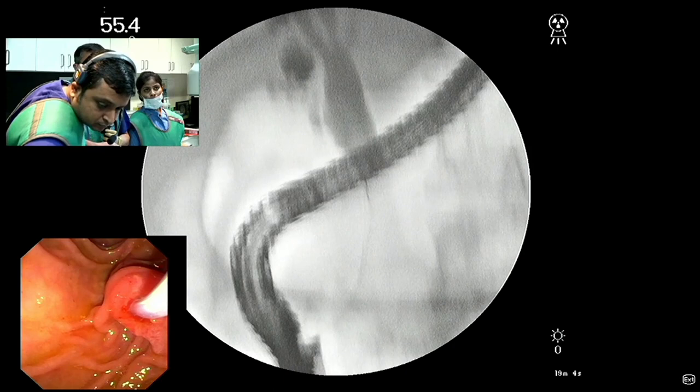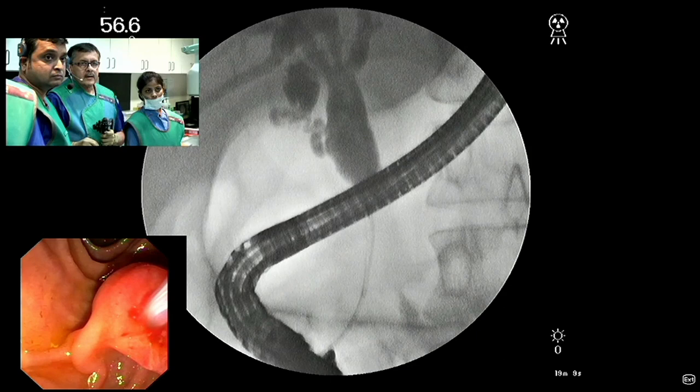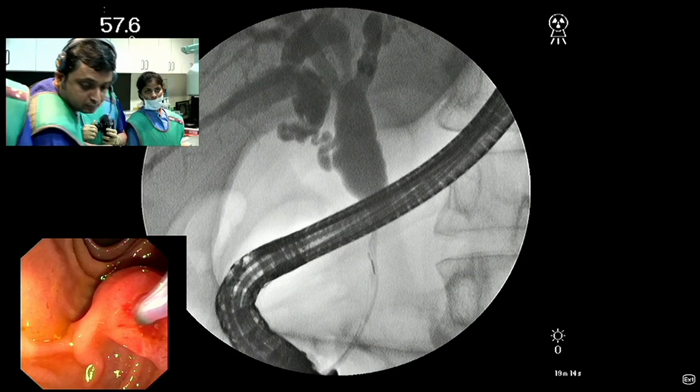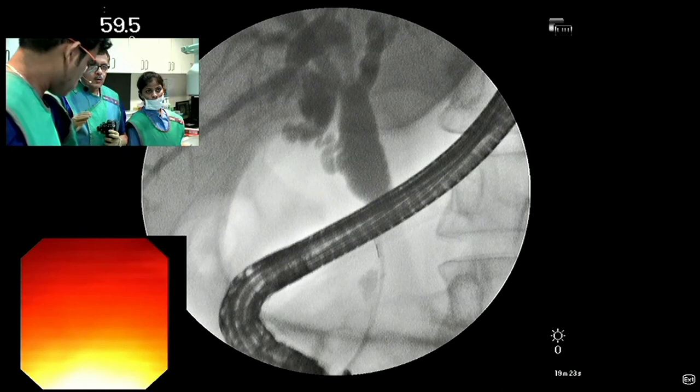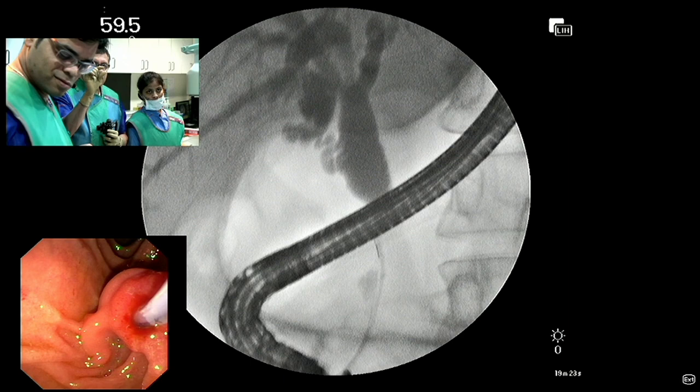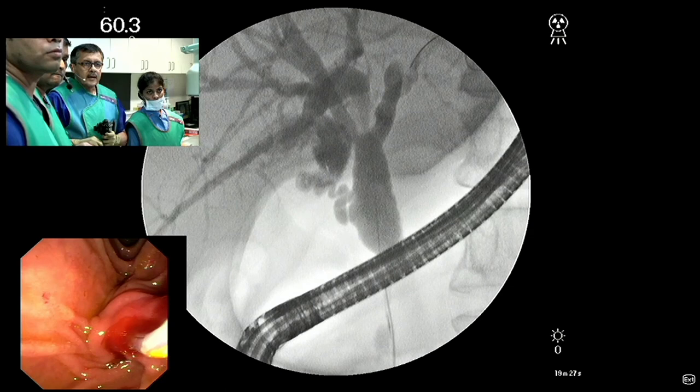This patient has already been diagnosed with an adenocarcinoma on EUS, so I don't need to take any brush cytology, though in this case, because it is a CA head pancreas, the chances that brush cytology will be positive are quite low, because this is more like an extrinsic infiltration. So you can see the lower portion of the CBD, and there is a stricture in the middle. So I leave the guide wire inside now.